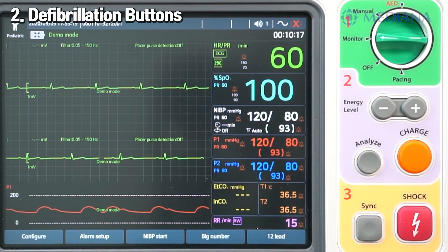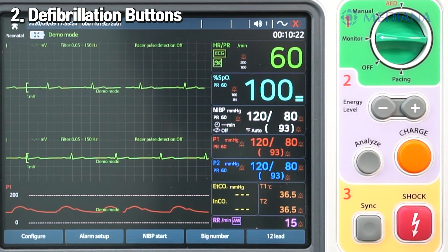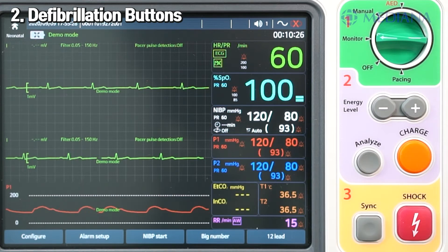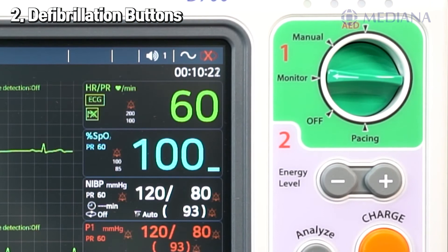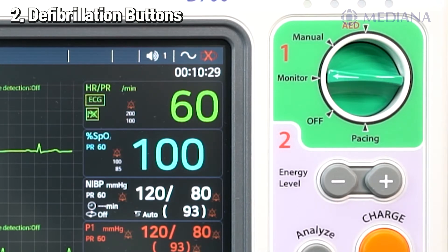Moving on to the right side, there are buttons related to defibrillation. Each defibrillation button is color coded according to the defibrillation stage, which increases the user's visual convenience. The mode selection knob selects four modes of operation: AED, Manual, Monitor, and Pacing. Just turn it to the desired mode of operation.